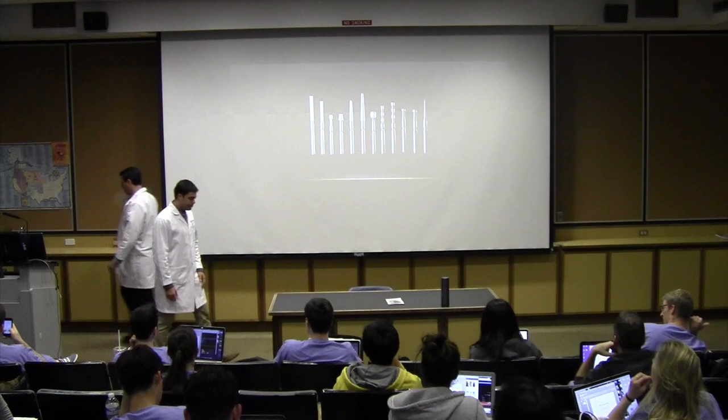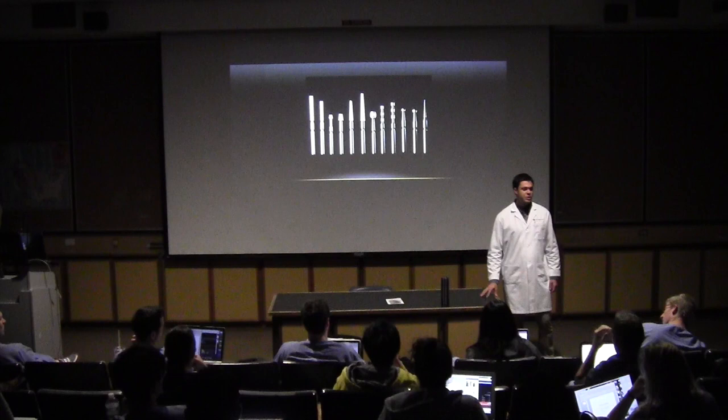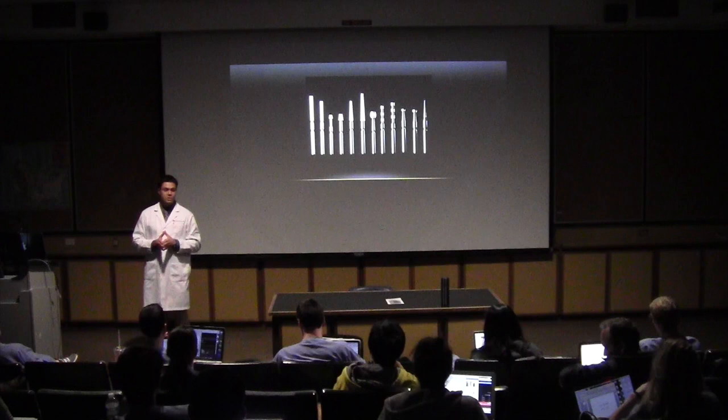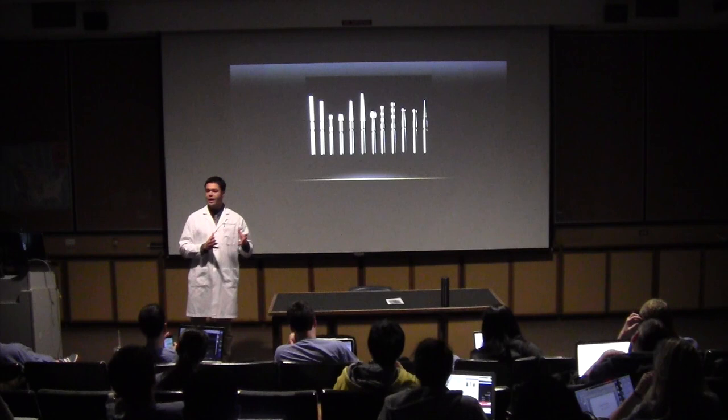Okay. Guys, last week a lot of you came to me in the lab and asked about the diamond points used to do this type of preparation. So I put here some diamond points. The most important thing is that you understand what will happen in the tooth depending on what type of diamond point you are using. Don't worry about memorizing numbers of diamond points, because depending on the brand, the number will change, even depending on the country that you are going to work in.